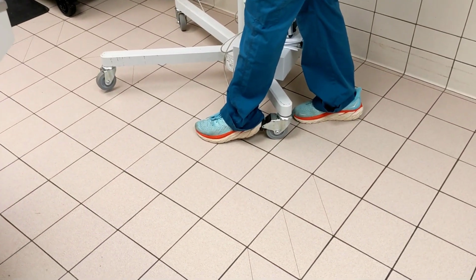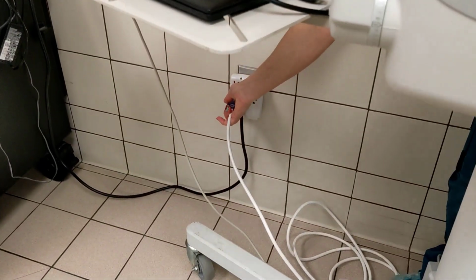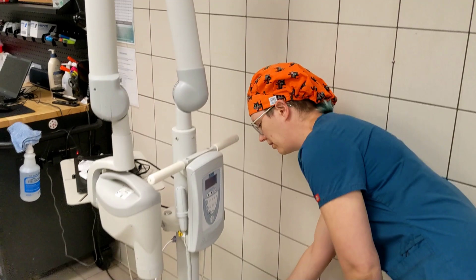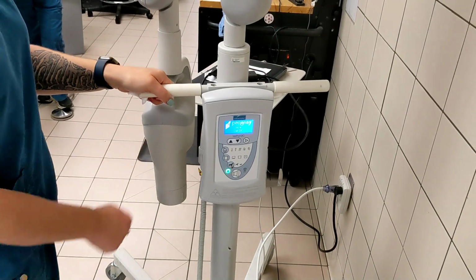When you are ready to set up the machine, first lock the wheels in place so it does not roll around, and plug in the machine. With the wheels locked and the machine plugged in, flip the switch on the bottom panel to the on position. When the machine is turned on, the display panel will light up.